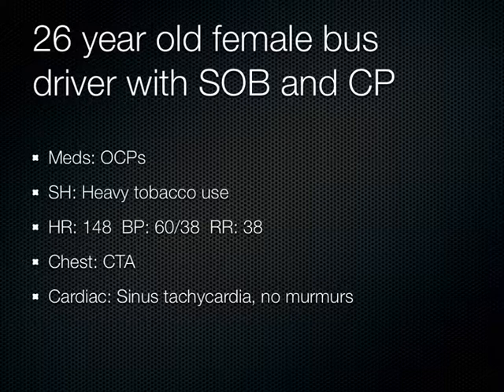Okay. So can you put someone like this in the CT scanner? You could, but... Have the medical students seen this too? No? Oh, good. Okay. So what does a PE look like on ultrasound?